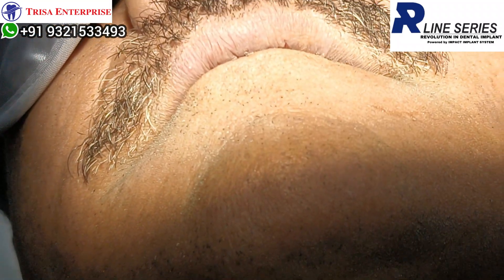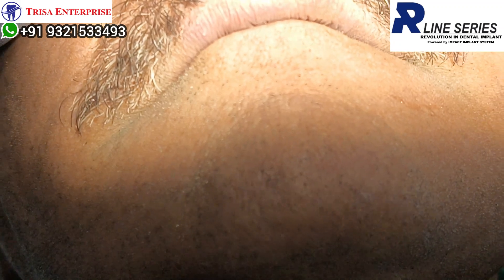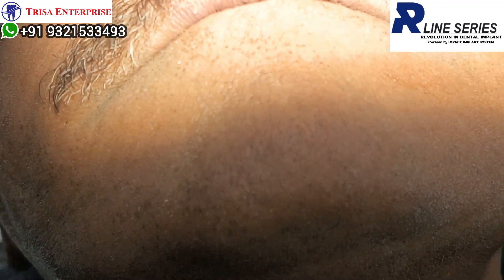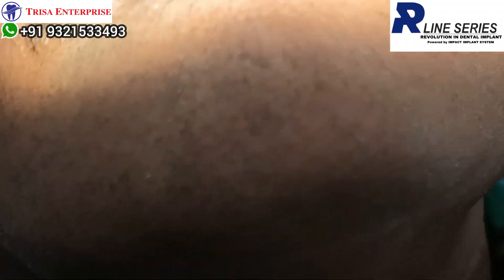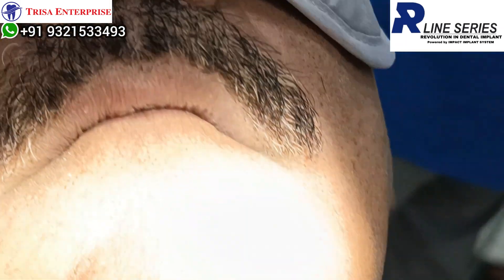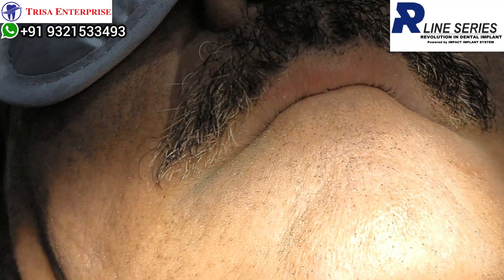Height and width are most visible — it's an immediate expression. Width is there, height is already 11.5. For KOS MU implant — please don't get confused, this is only for KOS MU implant — select 3 to 4 mm lesser than the length you are getting. So if I get 15mm, I select 11. Why? Because I want that 3 to 4 mm collar to be submerged, as I just explained. For KOS MU, not regular KOS, you drill 4mm more, or alternately the drill length will be 4mm shorter. The collar is around 3.5mm, so it will nicely get submerged.